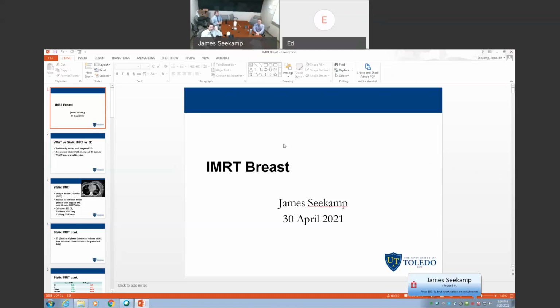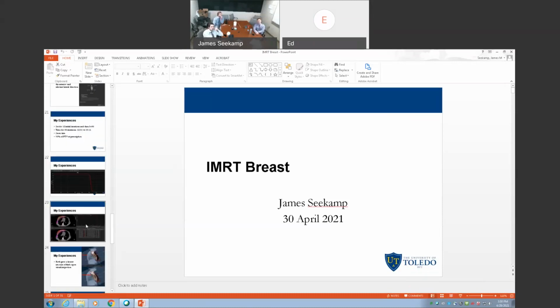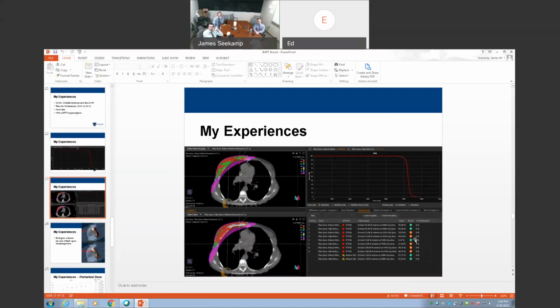I know it's like a nice finishing touch to try to get it to stay open more. It kind of destroys the computer, but also the last plan that Cheyenne did, what made it more acceptable was allowing it to optimize a bit, because like you were saying, it was quite a bit of 105 once you switch off that virtual bolus structure. Right. I'd be interested to know how many places sweep this problem under the carpet and don't take flash into account with IMRT and VMAT. But we might never know the answer to that. So I'd be scared to know.